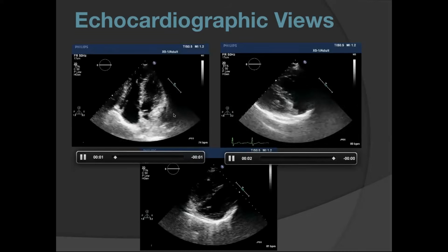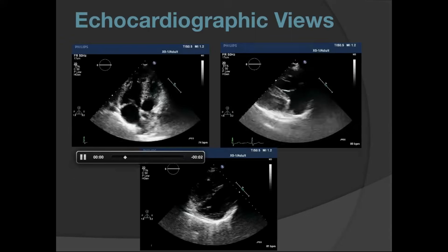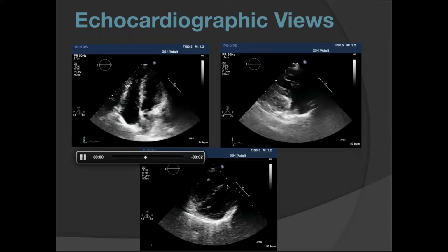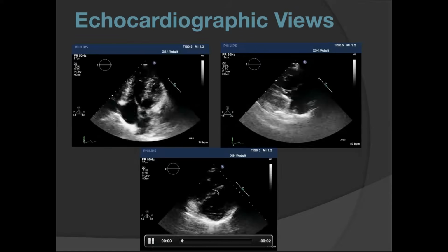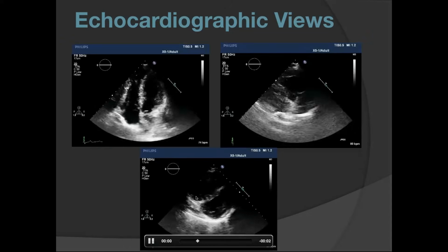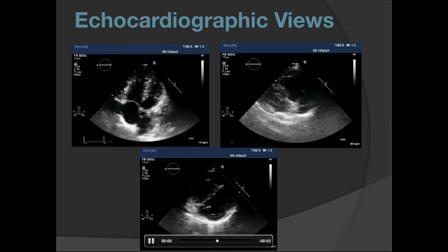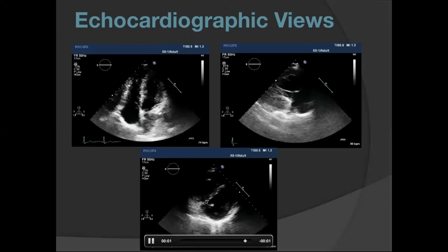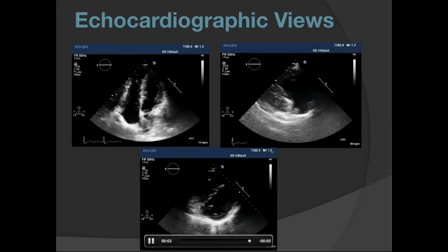These are very obvious images of an abnormal right heart where the septum is bouncing, cooperating with the right ventricle rather than with the left ventricle, which is normal. You can see the short axis view where septal shift is occurring, a very detailed explanation by Dr. Hansa. You can make out looking at this whether there is predominant pressure overload or volume overload or both. If you look at this septal shifting or D-shaped left ventricle, and then AP and septolateral diameters are taken.